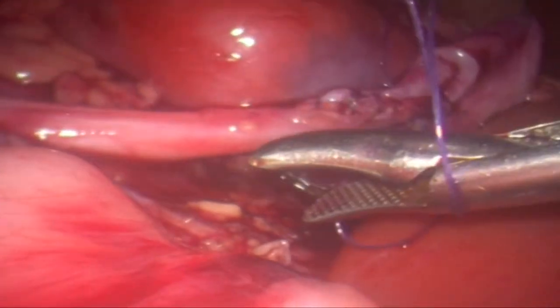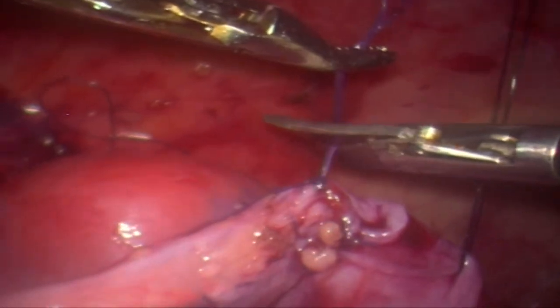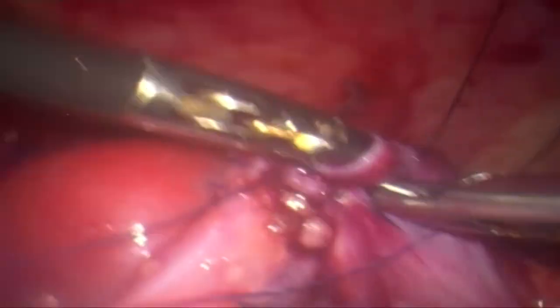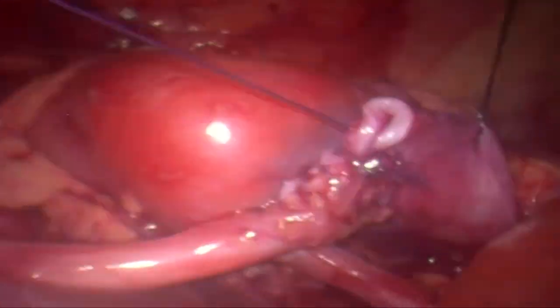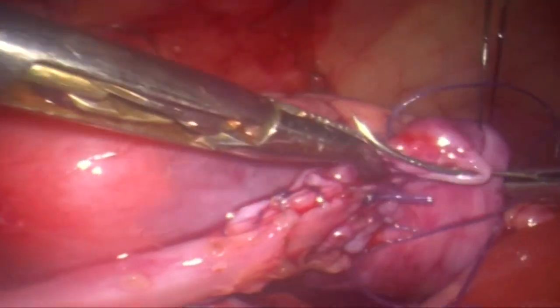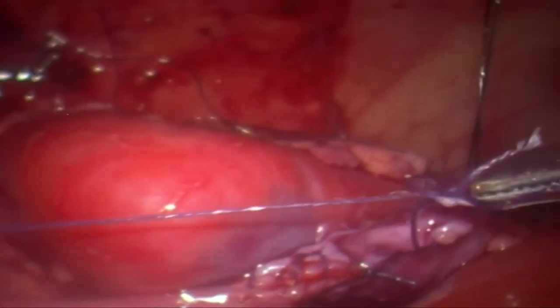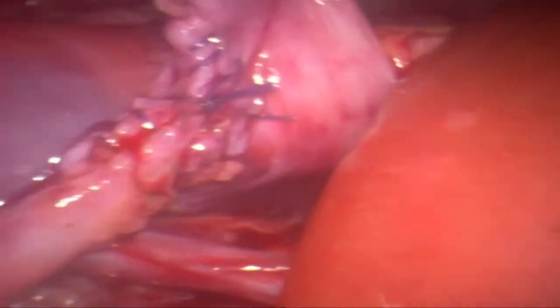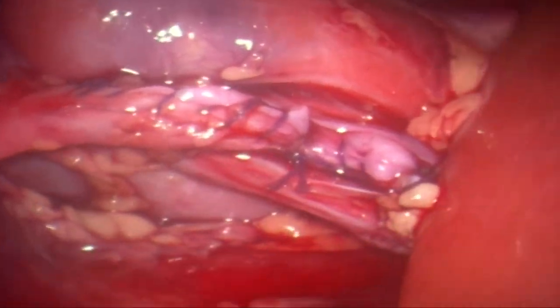In this case, we did not leave a drain because it was a very clean anastomosis and there was not much collection. You can now see that the lower polar vessel is nicely placed behind the pelvis, and the anastomosis is now facing anteriorly. That is a good result for a case which had difficulty because of posterior malrotation of the pelvis as well as the lower polar vessel.